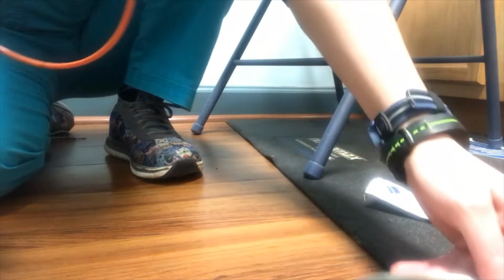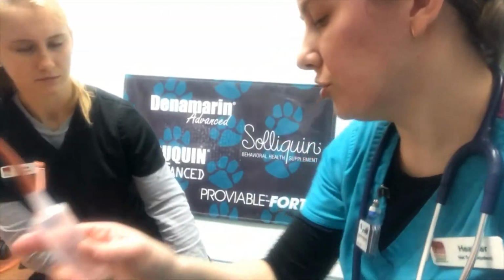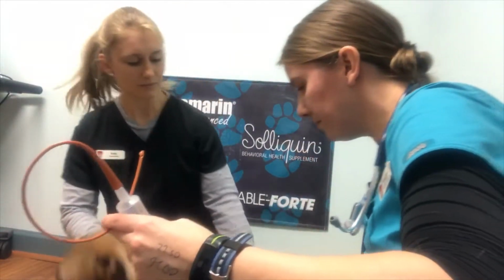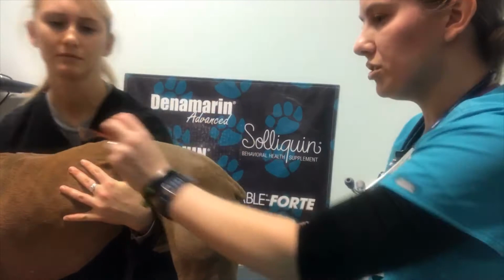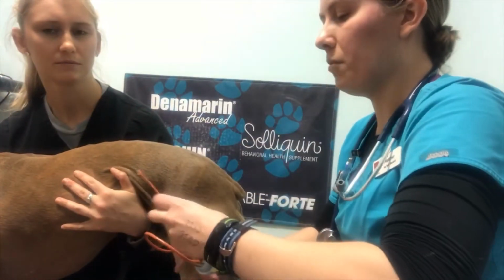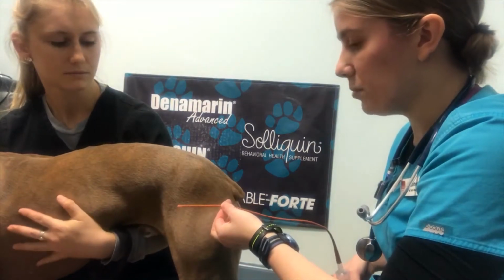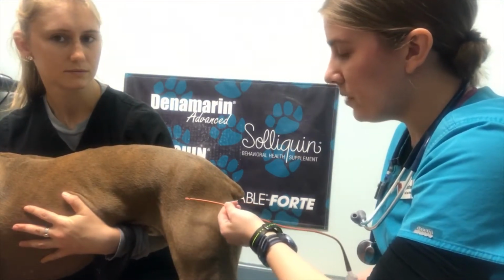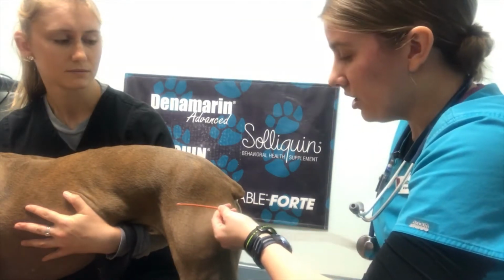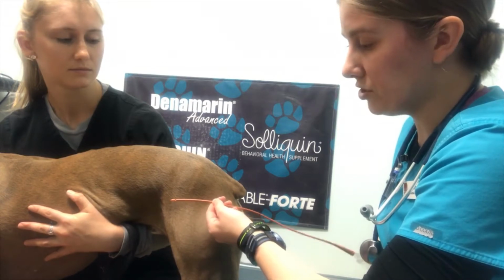Alright, so now I have my solution. I'll place it up here so we can see Dozer here as well a little bit. For this, when I insert it, you're going to just enter it straight into the rectum. Obviously, the purpose of an enema is to get rid of any potential constipation, any blockage back in there. So you're going to insert it into the rectum as far as you can push it in there, and then you will start to slowly administer the enema.